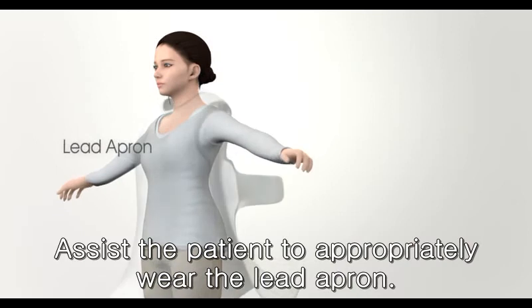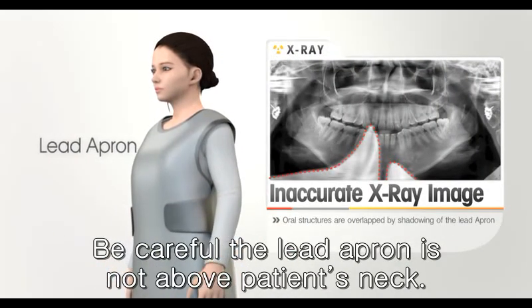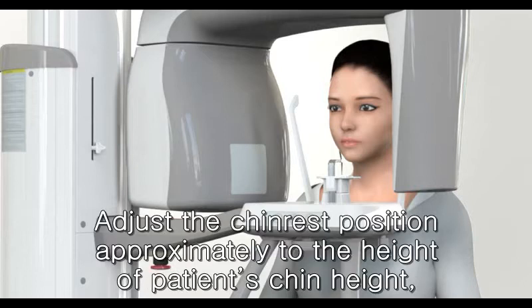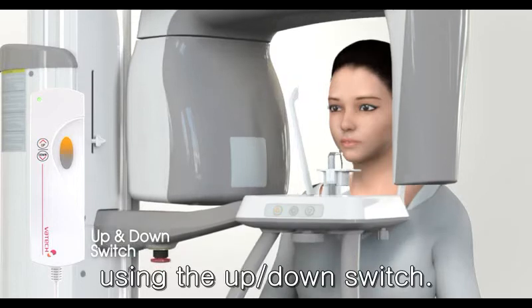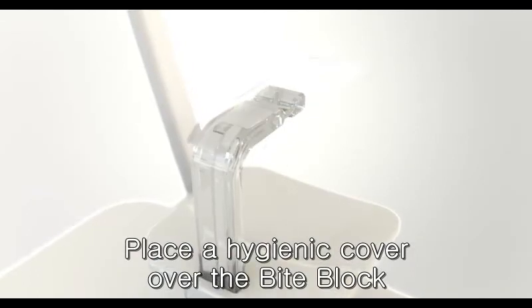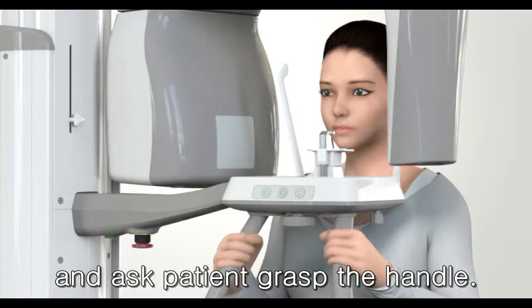Assist the patient to appropriately wear the lead apron. Be careful the lead apron is not above patient's neck. Ask the patient to stand in front of the handle frame. Adjust the chin rest position approximately to the height of patient's chin using the up-down switch. For Pax Eye, the chin rest position can be adjusted using the up-down switch on handle frame. Place a hygienic cover over the bite block and ask patient to grasp the handle.